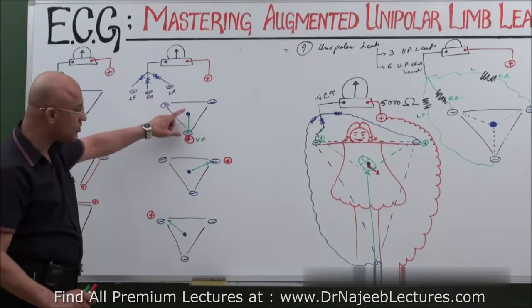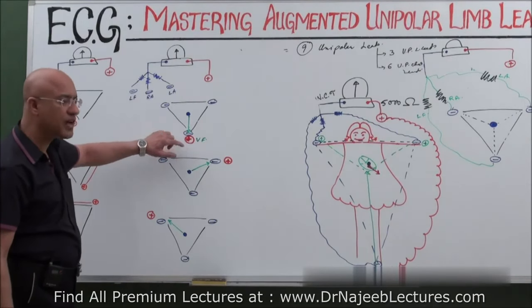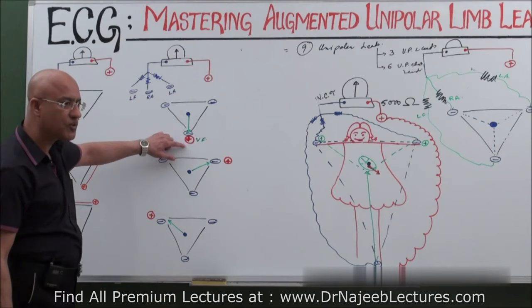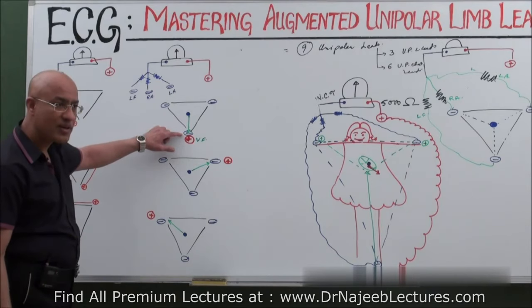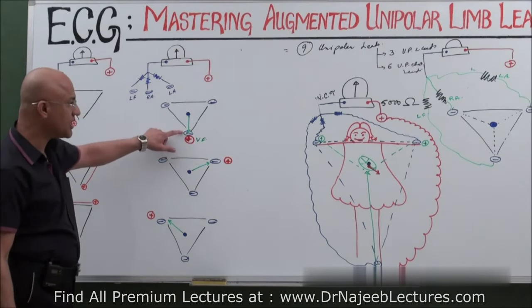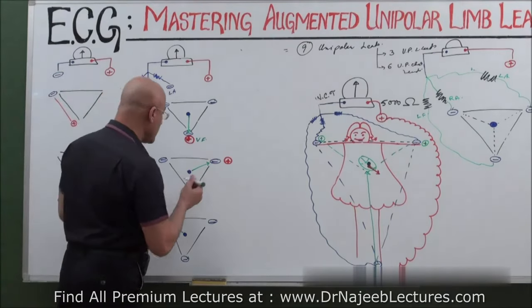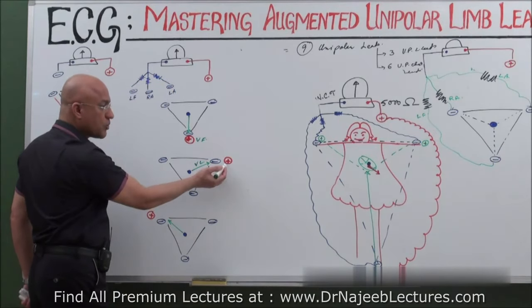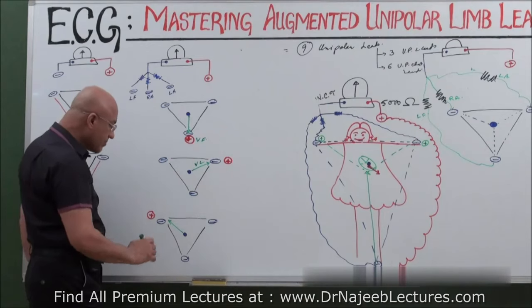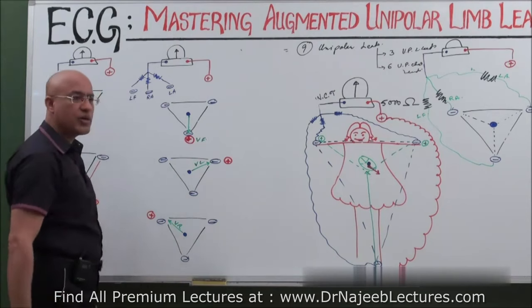Another issue why voltage is dropping is that wherever you put your exploring electrode or positive electrode, at the same place there is also negative. And that was reducing the potential. For example, in VF, there was negative with the positive. In VL, in the left arm, of course you put the positive, but also there is negative. In case of VR, with the positive, there is also negative.